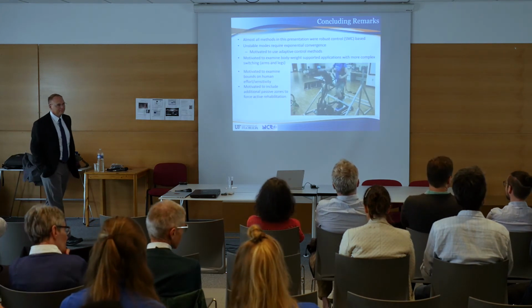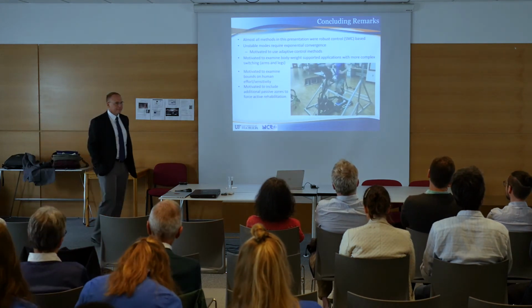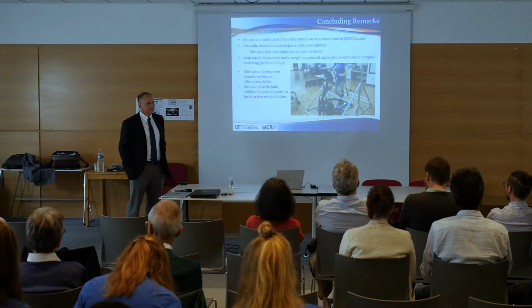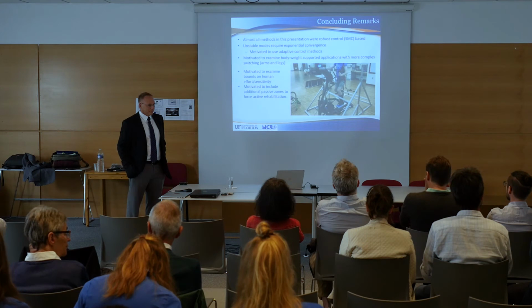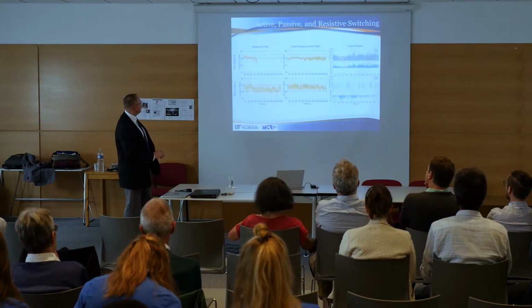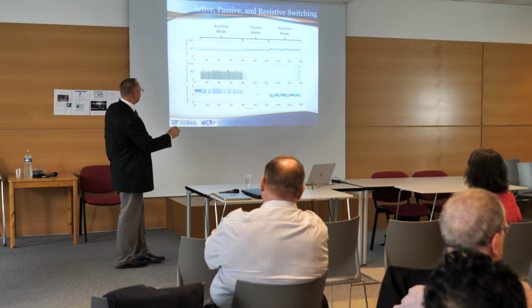In the figure before, you were showing that electrical stimulation is trying to reach this 50 RPM limit. Why is it not reaching it? Is the patient working actively against it? Yeah, exactly. In a healthy patient, you apply stimulation and then more stimulation to reach your goal. Shouldn't it go up a little during this period here? Yes, the assisted mode.